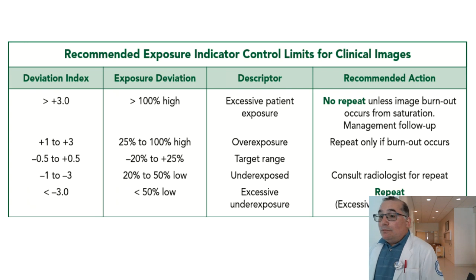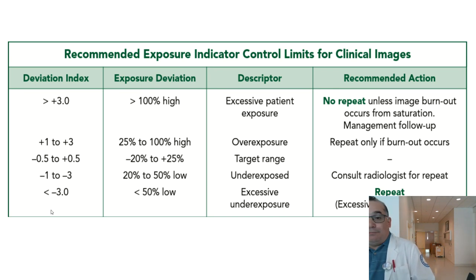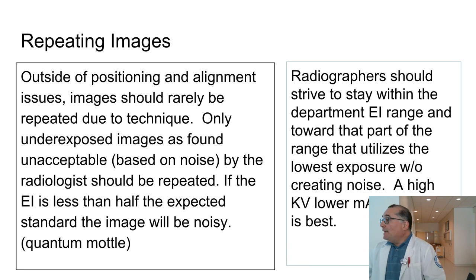Now, the DI, though, would really be nice, right? If, again, all the manufacturers could get on the bandwagon and create this standard that everyone could use instead of it being all over the place. Overall, though, when it comes to repeating an image, because of the wide latitude that you have in CR and DR, it shouldn't be technique, right? Unless you have an incredibly high exposure, you're not going to get saturation leading to a repeat. And again, I'll show you what that looks like. And often enough, because of what's known as radiation creep, you're not going to get an underexposure because people are likely to use more than they ever needed to begin with in the first place.